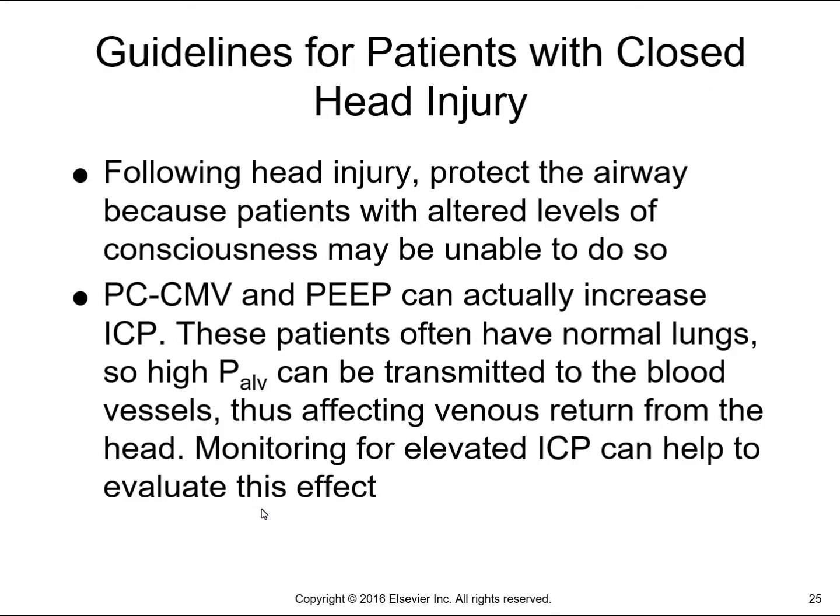All right, so if I have a closed head injury due to status post trauma, something falling on my head, or I played football and I lowered my helmet and I got jacked up because I missed the person I was going to tackle, and I tackled the cheerleader, right? That can cause some head injury. All right. So for any type of head injury, again, we want to put them on pressure control. We want to make sure we have some PEEP, but not too much PEEP, because actually it says here pressure control and PEEP can actually increase ICP.